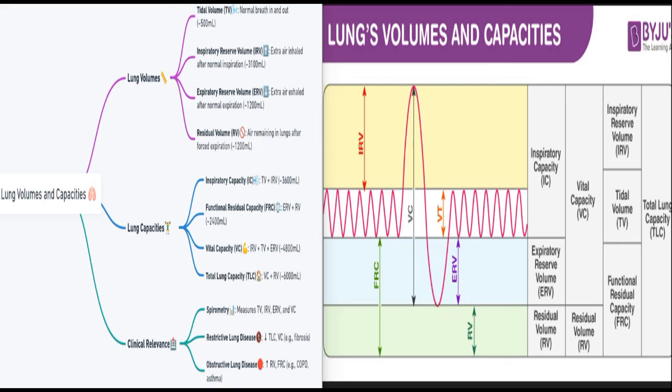It indicates there is a significant airflow limitation, but having the forced vital capacity lower than the lower limit of normal, then that's restrictive. It could also be mixed, but with the FEV1 FVC ratio being the same, 70 and 70, it does not confirm obstruction.